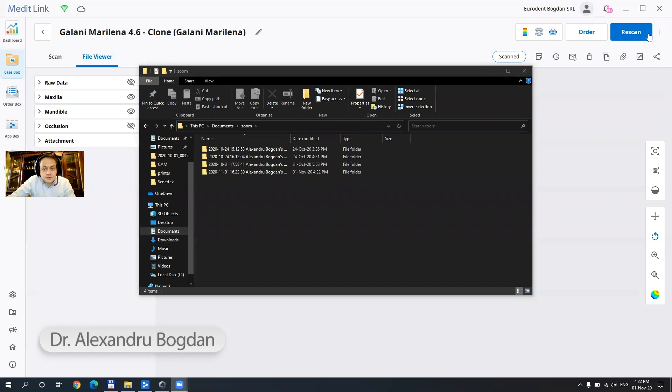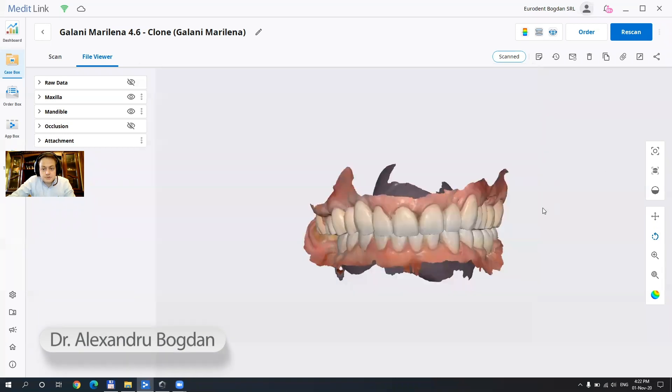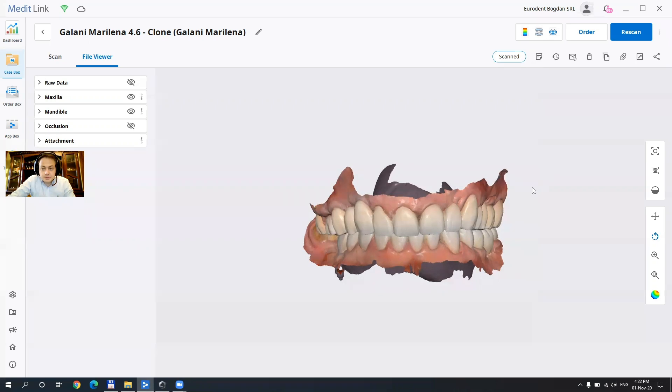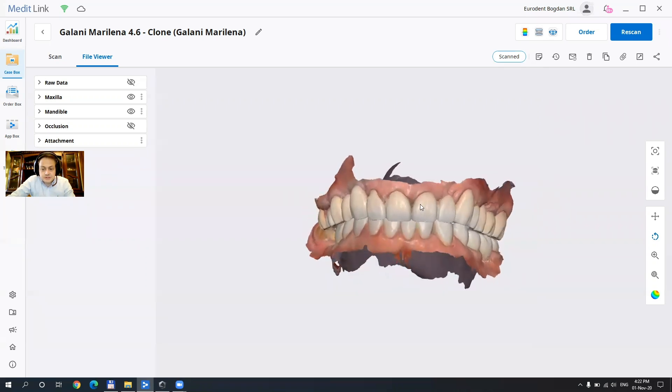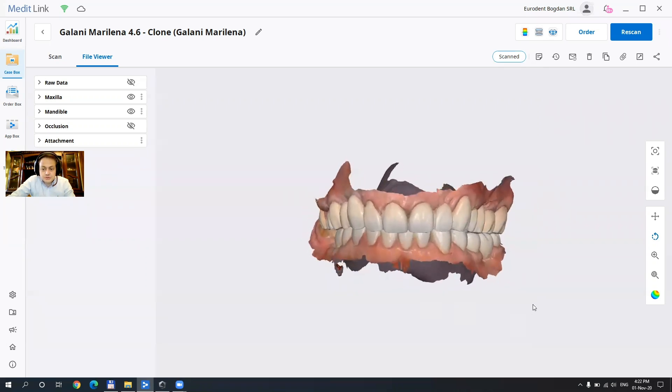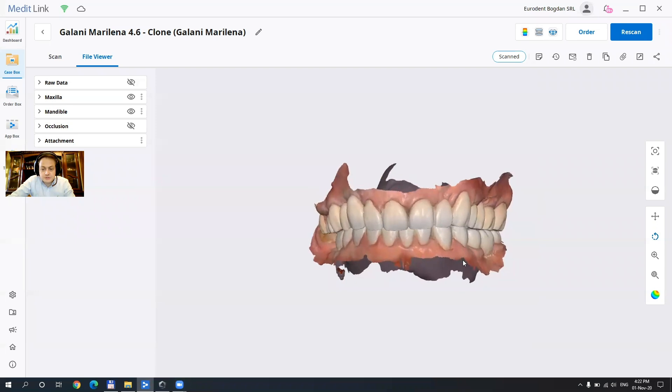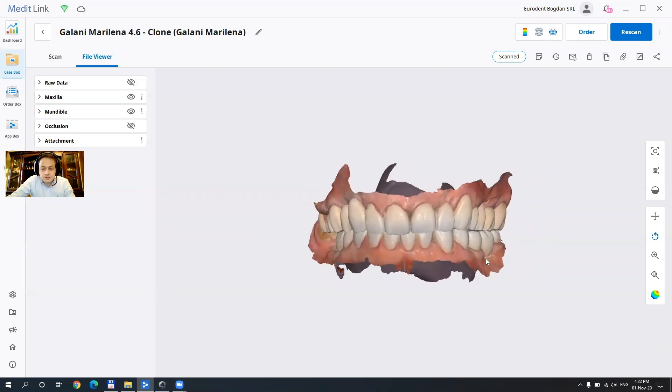Hello guys, in this video I'm gonna show a new app that Medit has been working on. It is called Compare. It is intended to show the differences between arches of the same patient and the evolution of this patient in time. Let's just jump into it.